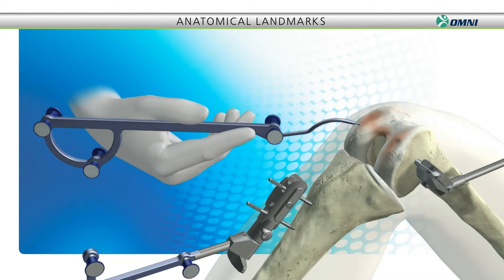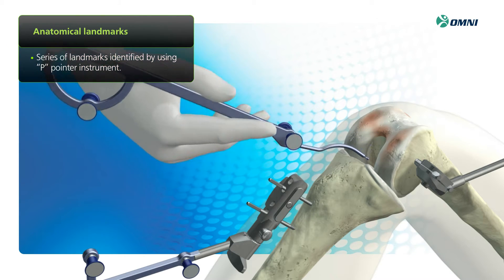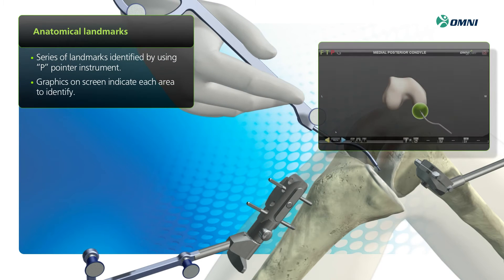The next step is to identify critical anatomical landmarks. Simply follow on-screen prompts and touch the pointer to each landmark.